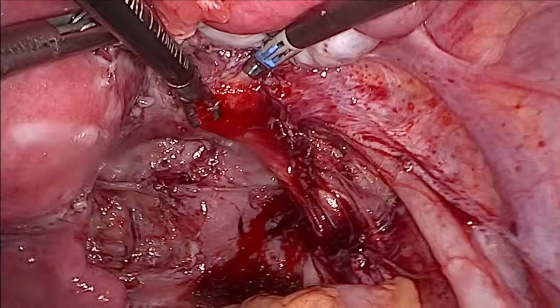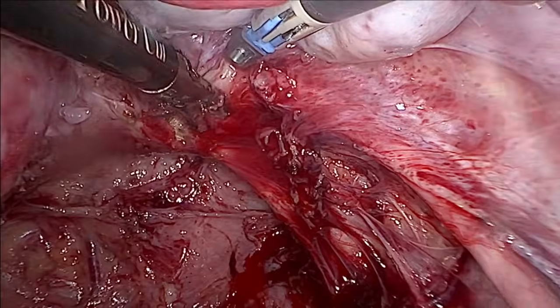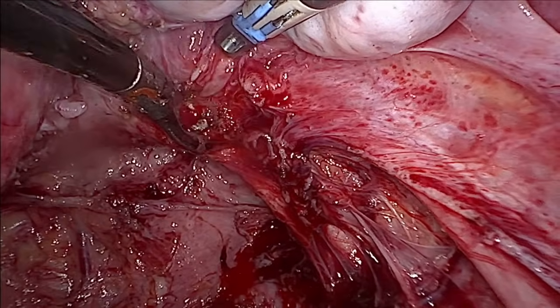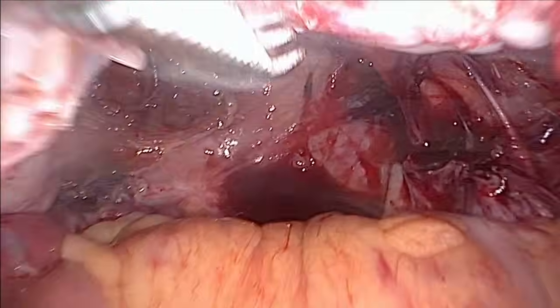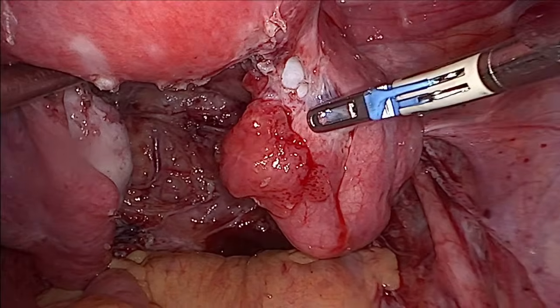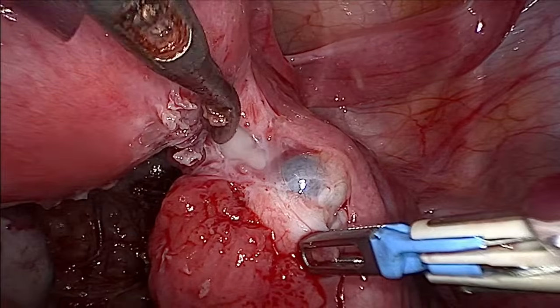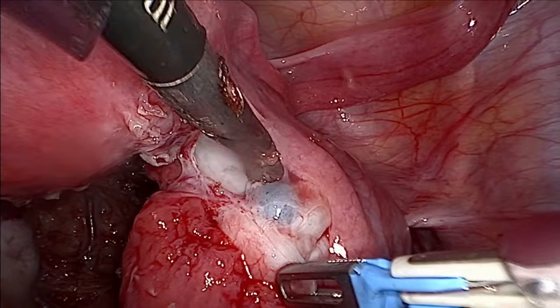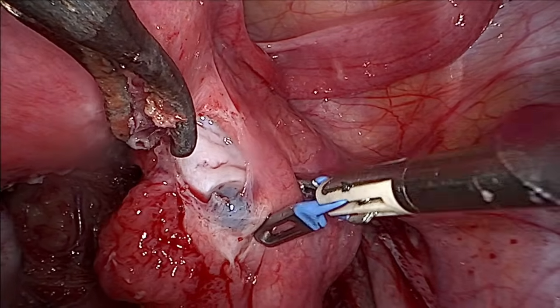There's some bleeding there. So this is the adhesion of the tube here. Okay, slowly, steadily, we try to release all these adhesions here.